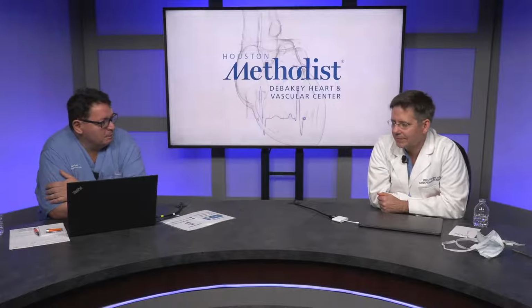Cool. My other question is, do you have any different flow volume in the upper arm or lower extremity? Because I think when you run out of options and you don't have any options in the upper extremity, sometimes we see lower extremity AVF. Yep. So the lower extremity AVFs almost always are higher flow than the upper extremity just because of the size of the vessels. The requirements are the same. Really, they only need to be flowing at 600 cc's a minute or more. Clearly, those, because of the size of the vessels, almost always are flowing quite a bit more than that.